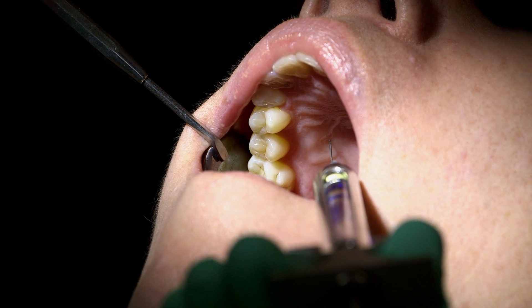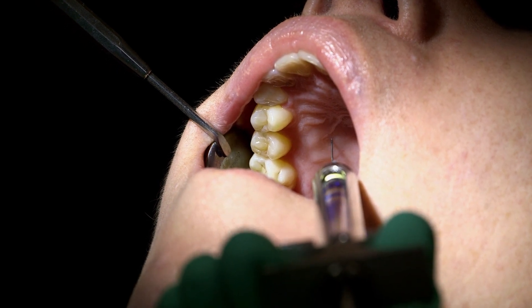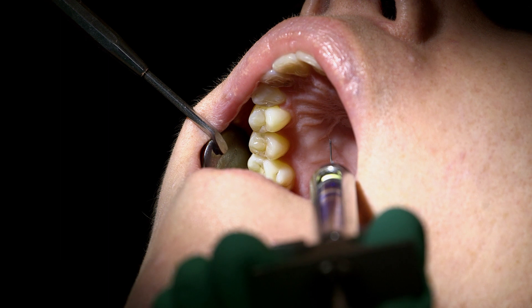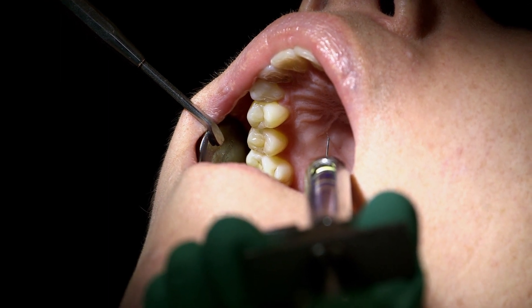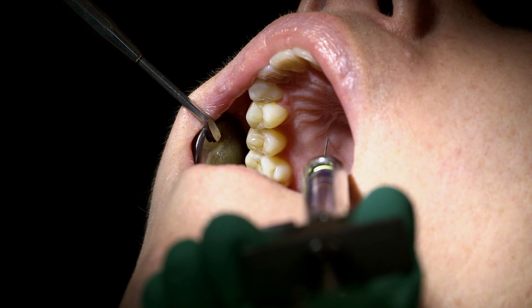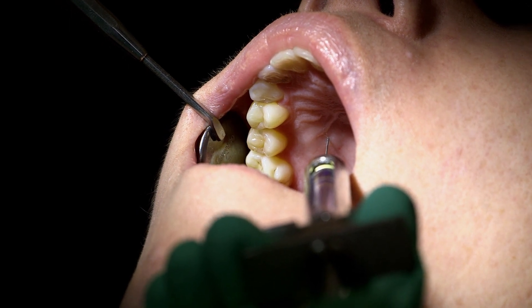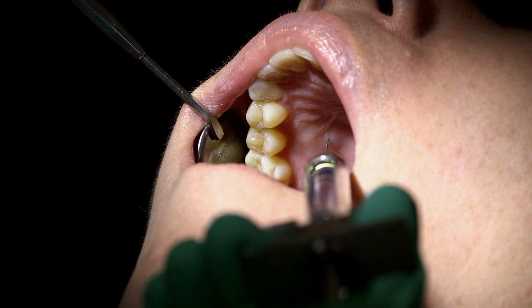The needle is inserted approximately 1-2mm, then slowly deposit 0.1-0.3mL. Deposit slowly and you will see the tissue blanching. Carefully withdraw the needle.